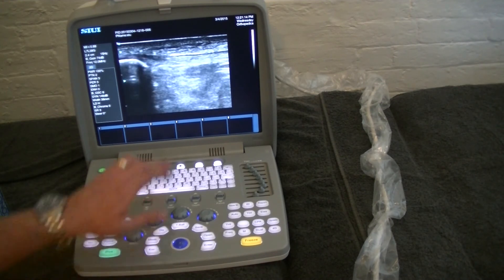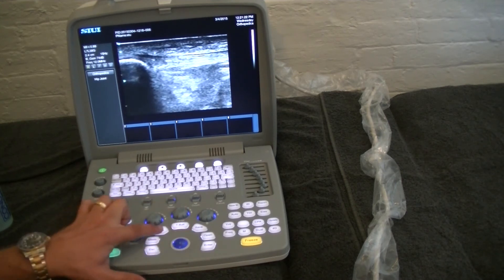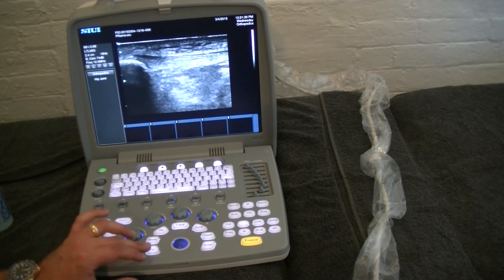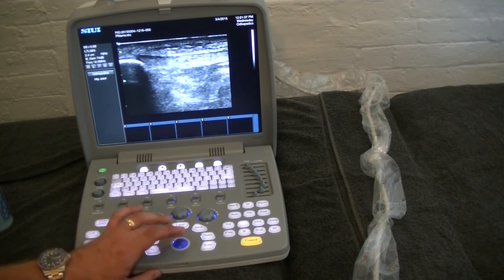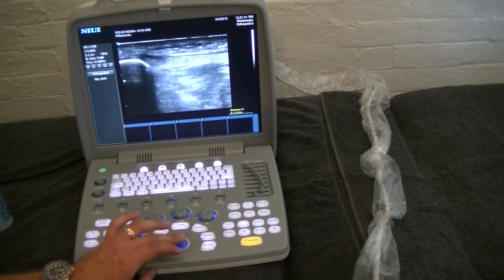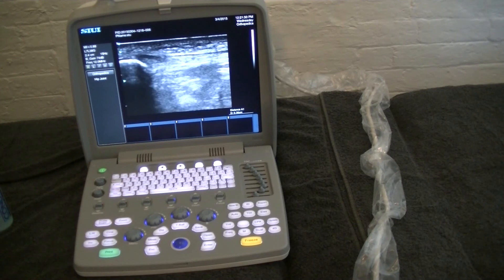Now if we wanted to measure something — let's say the thickness of the tendon — we'll hit measurement, go to distance, and we'll get our little marker on the screen. I'm going to measure just from inside, hit enter, slide down to the lowest portion of the tendon, and hit enter again. That's going to give us our distance down here.